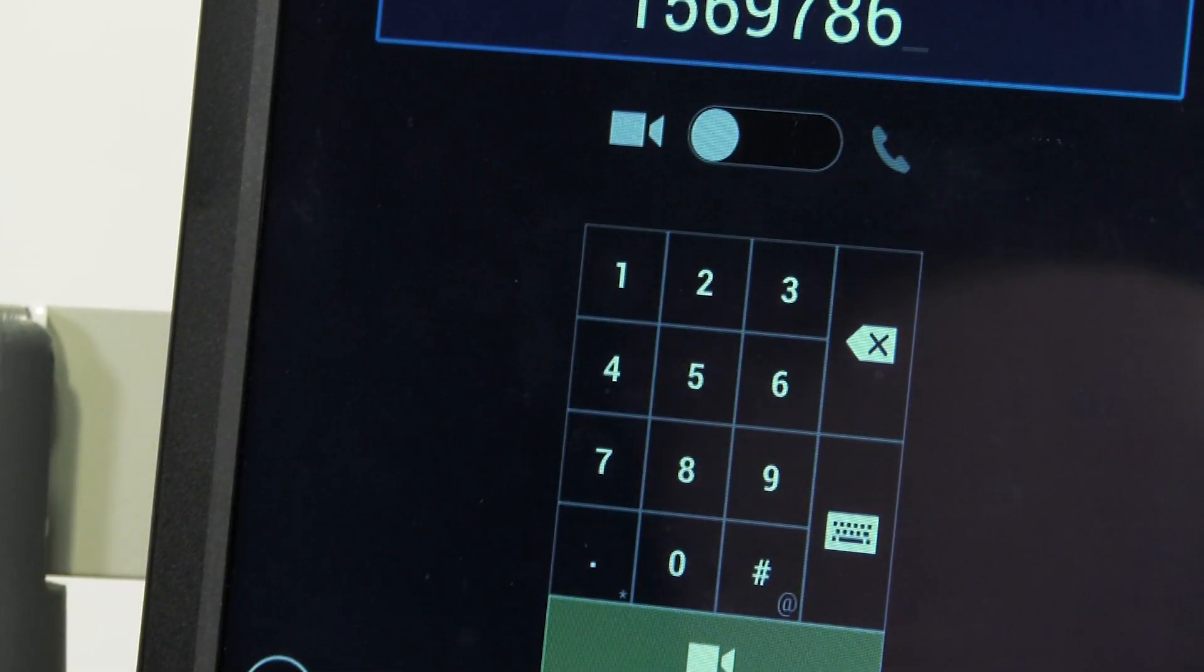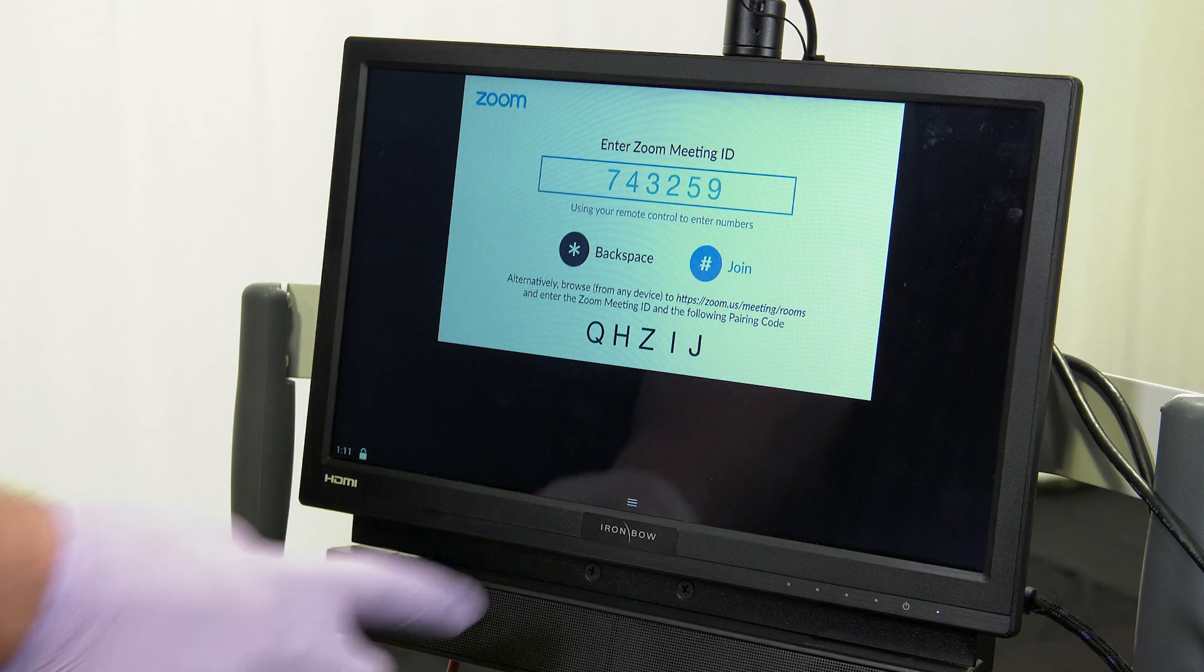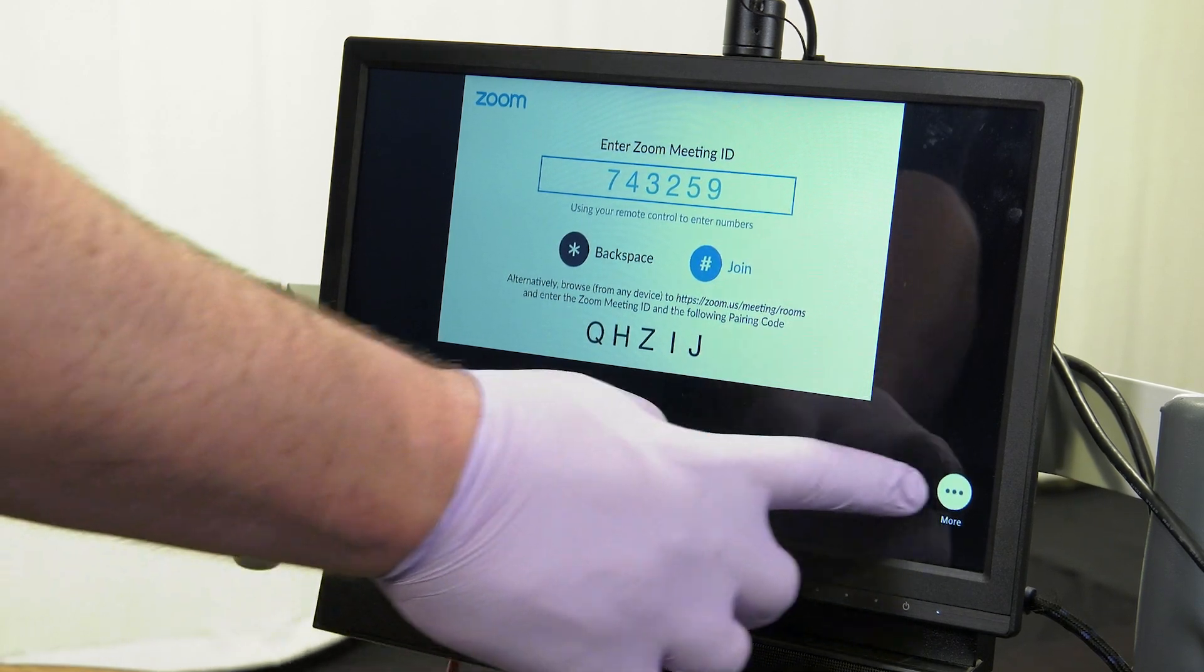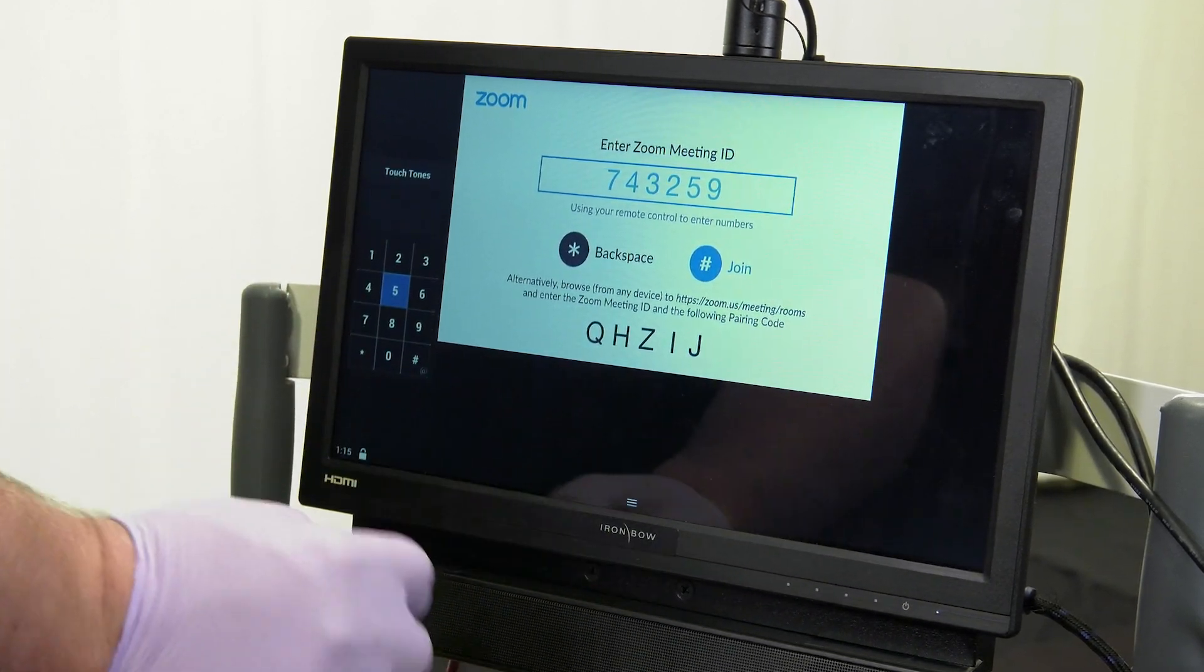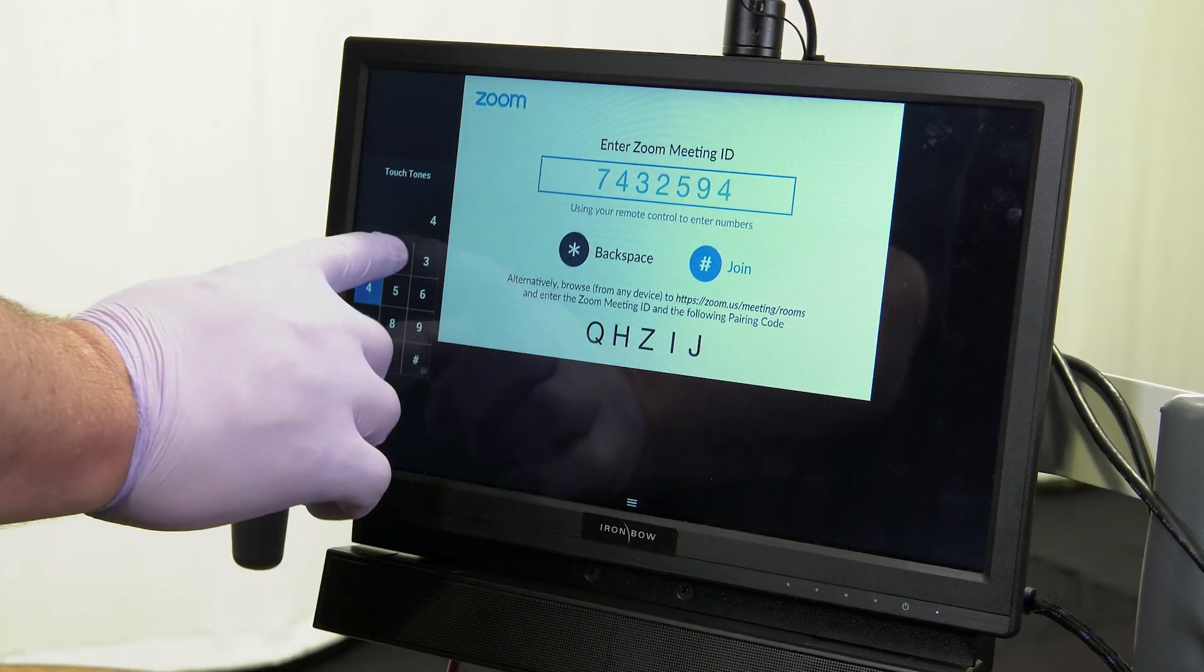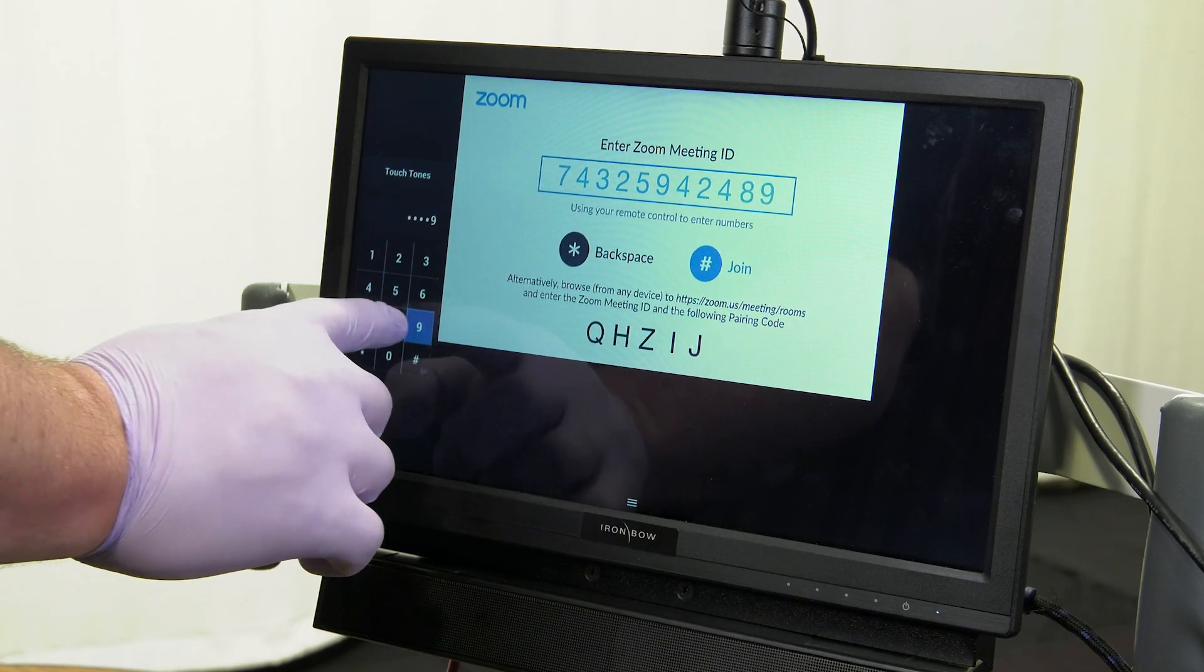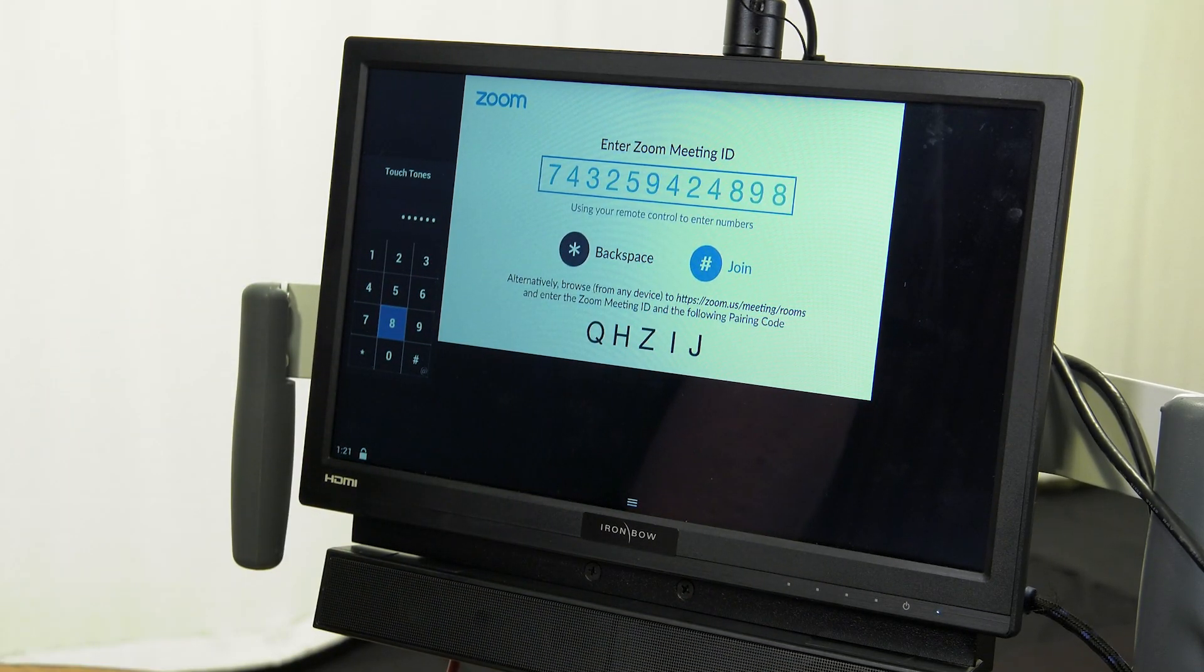Tap the on-screen menu, go to More Touch Tones, and use the on-screen dial pad to enter the meeting ID. Enter the passcode if necessary.